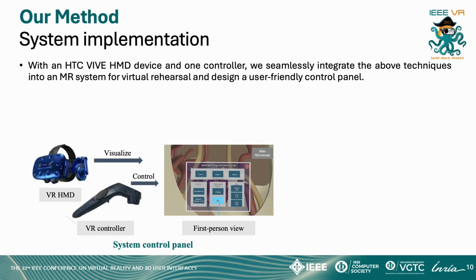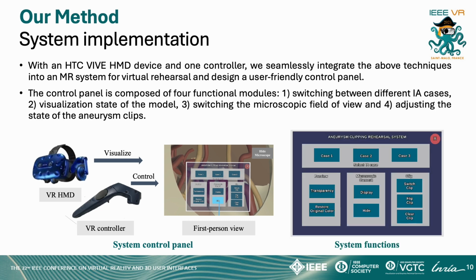Finally, using an HTC Vive HMD and a controller, we integrate all of these techniques into an MR system for virtual rehearsal. We also design an intuitive control panel, which includes 4 key functions.